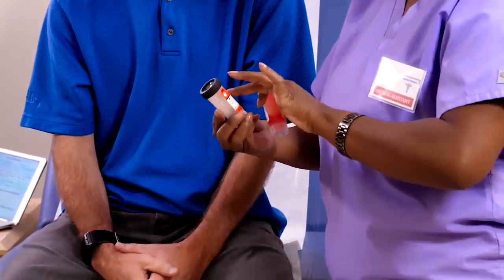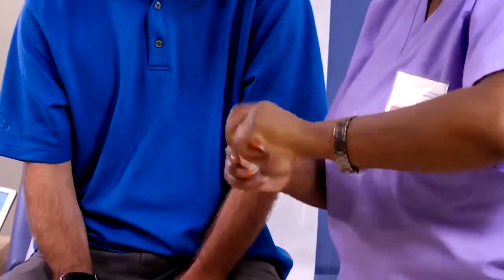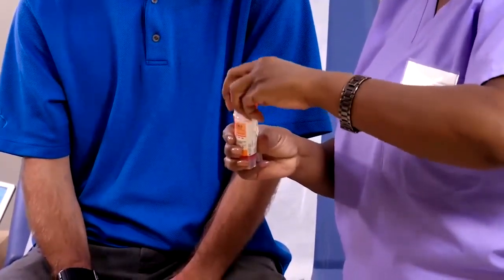You will also have these two other samples that you will have to collect. It's a red fill line on this one, and it's a black fill line on this one. The fluid that's inside of the samples, you need to make sure that you put enough stool in it for the fluid to fill up to the fill line. Okay. There is a spoon on the bottom of the cap.